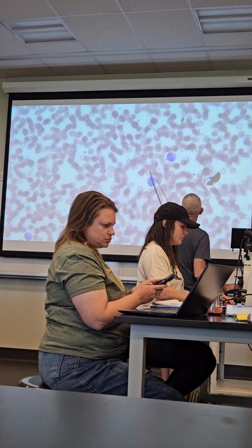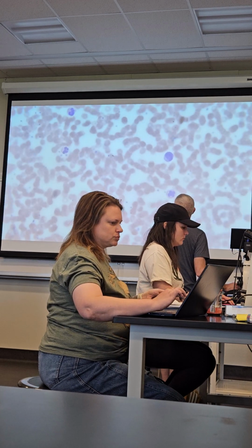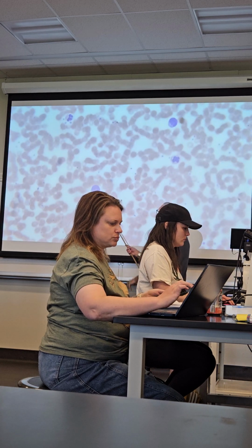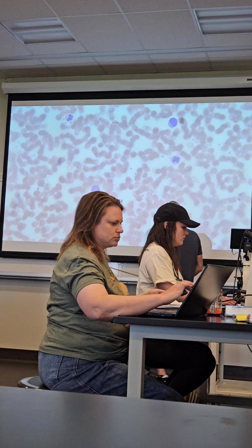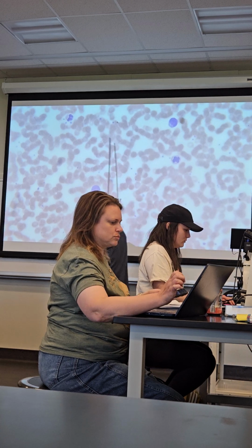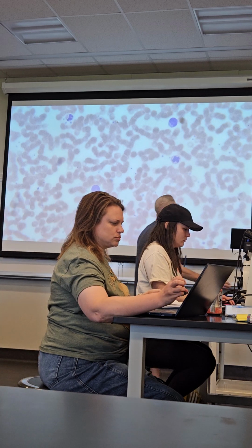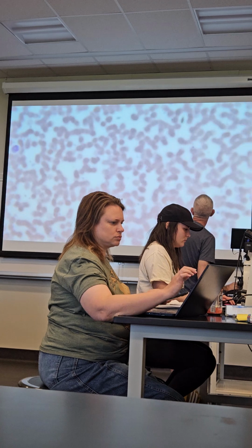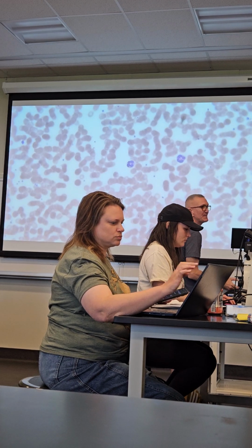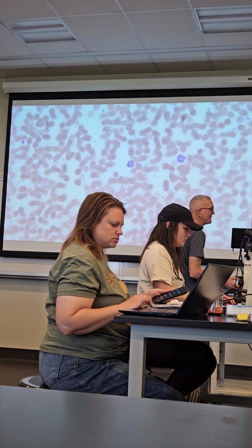What do you guys think that one is? Yeah, it's looking like a monocyte to me too. I use a better one though. That's a good one. That's a great monocyte. It's got a nice saddle-shaped nucleus. So this would be a mono, neutrophil. Yeah, they usually have anywhere from 3 to 6 lobes. And usually they just kind of put 3 to 4.